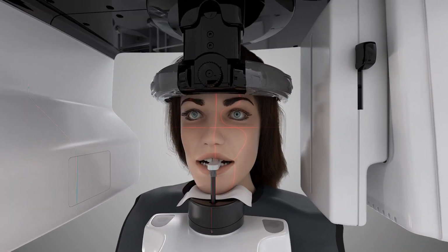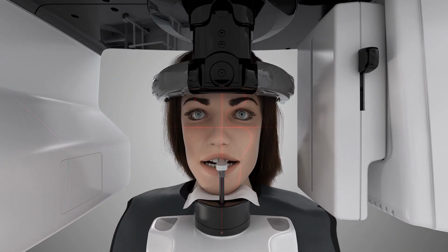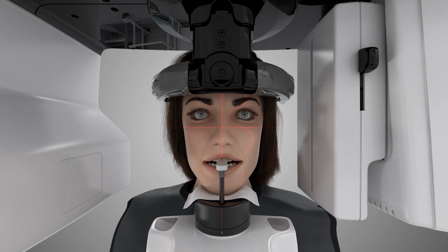Ensure the patient's head position is properly aligned with the mid-sagittal laser light. This vertical line should pass directly through the center of the philtrum. The head should not be turned or tilted. Compensate for misalignments by manually moving the patient's head into the proper position. If the patient's head is turned or tilted, the resulting X-ray images will be distorted.